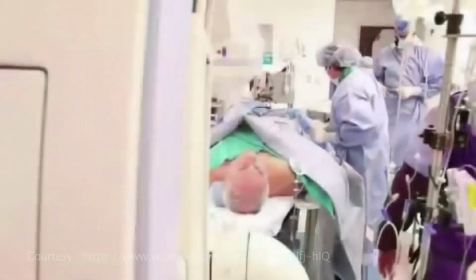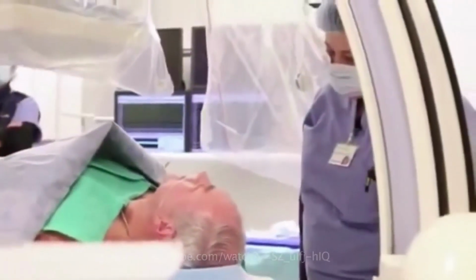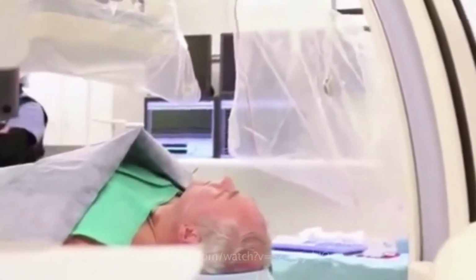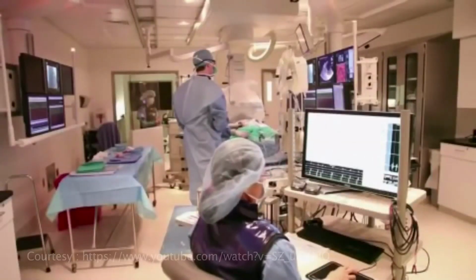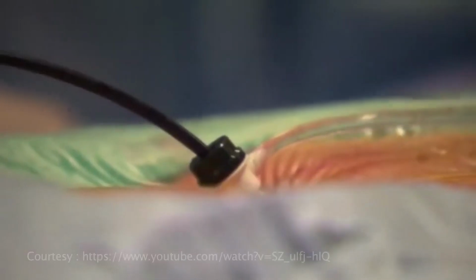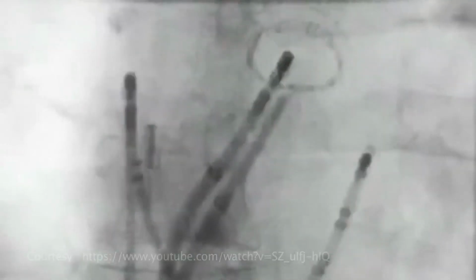We don't use general anesthesia usually. We use something called conscious sedation. And they're comfortably sedated, usually sleeping, but readily arousable. The procedure itself, from coming into the room to leaving the room, is probably around 5 to 6 hours. A lot of the time is spent in getting the catheters in, getting into the left upper chamber, and then at the end, getting everything out. So I would say about half the time is the ablation time.